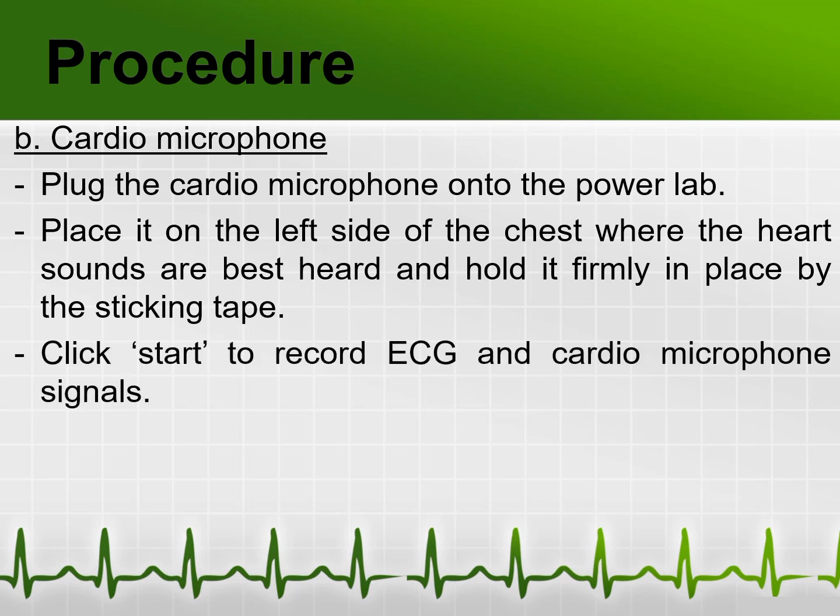Then click Start to record ECG and cardio microphone signals. After a few seconds, click Stop.